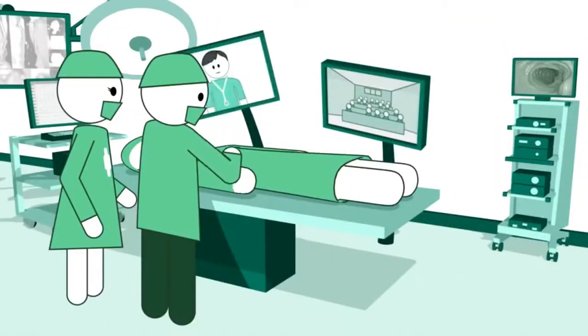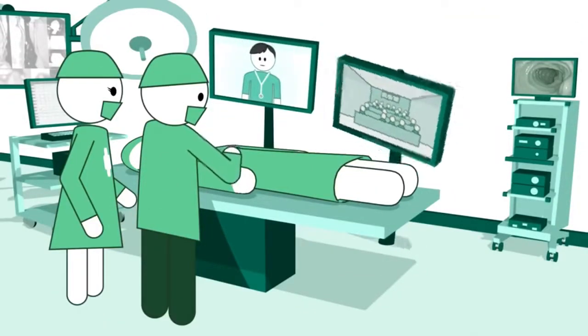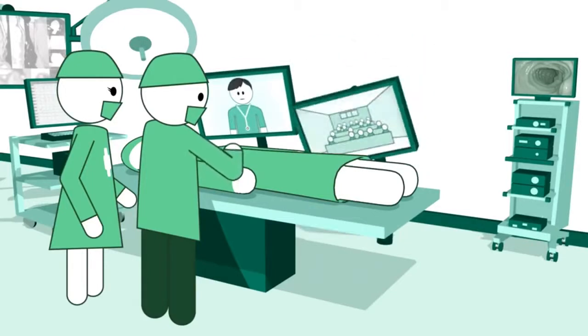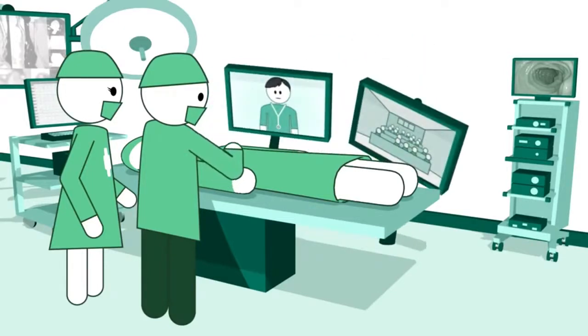Your colleagues will be able to observe operations from outside the OR, which means more staff can follow the procedure for better clinical results.